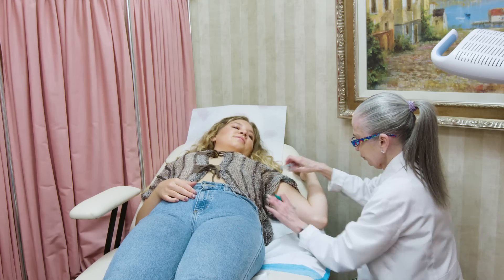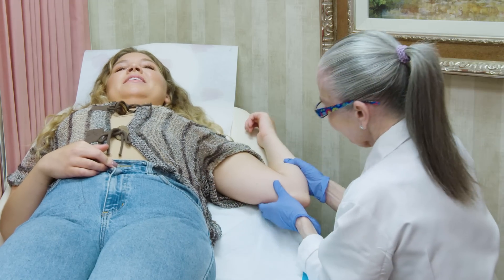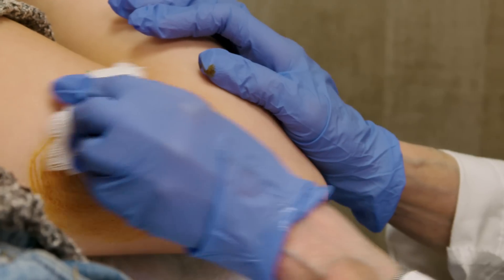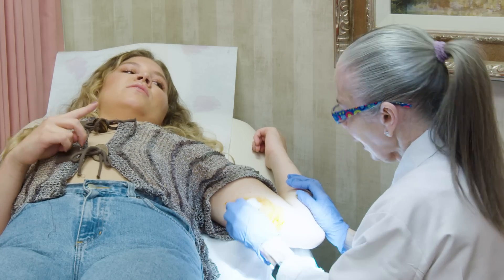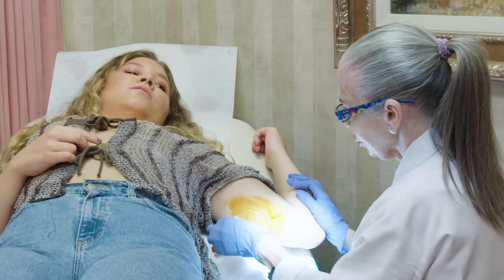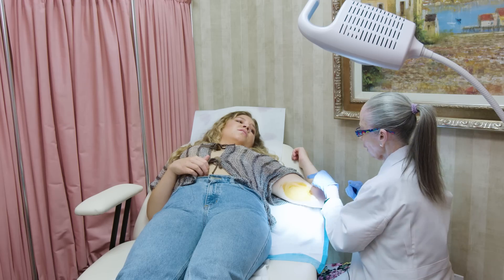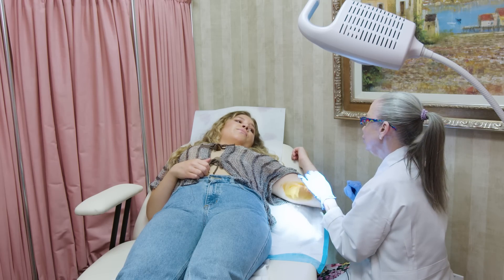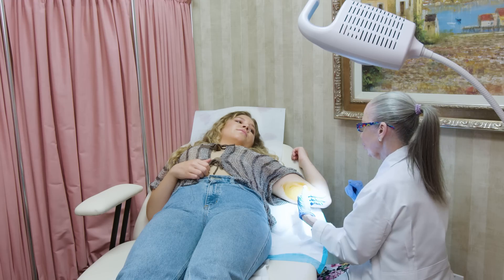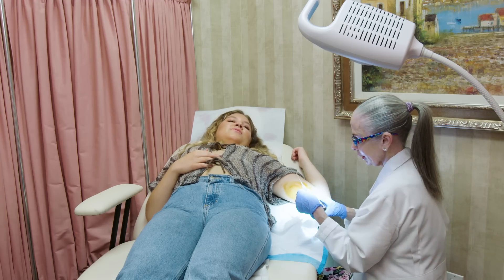So this is where we're going to insert it. You're such a calm patient. So am I going to be able to feel this in my arm? Yes, you'll be able to feel it with your fingers. Do they move ever? Not if I insert it in the right place — that's why I try to avoid this sulcus area, so it should not move. And if at any point you gain weight and we can't feel the rod, we can see it with an ultrasound image or an x-ray. This is what the dentist uses — it's the lidocaine.